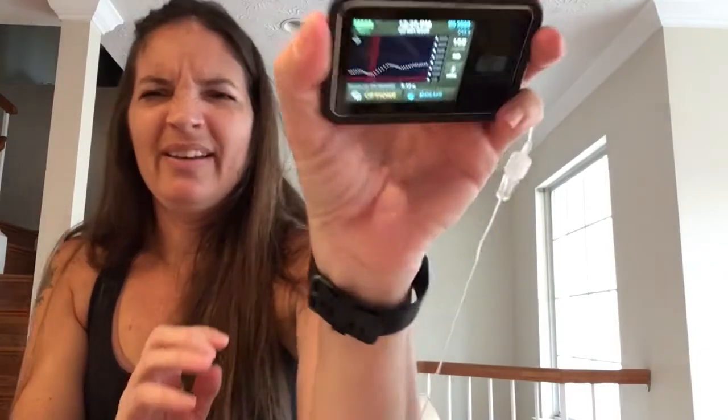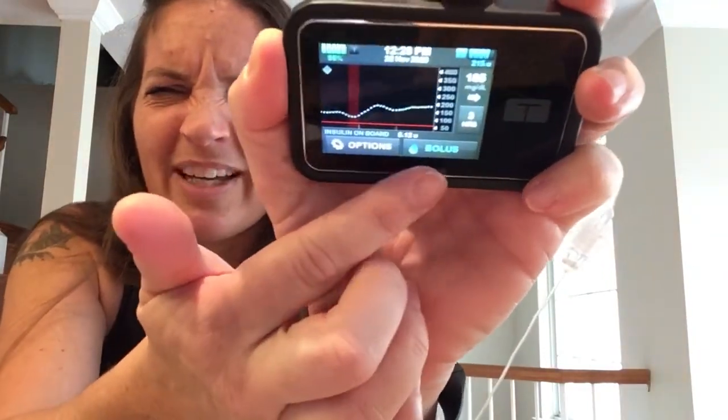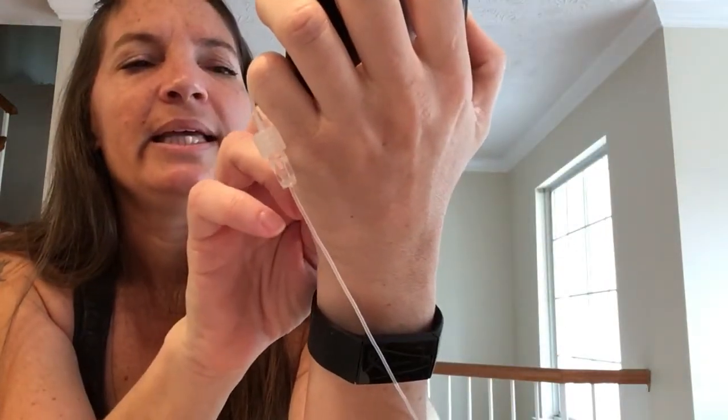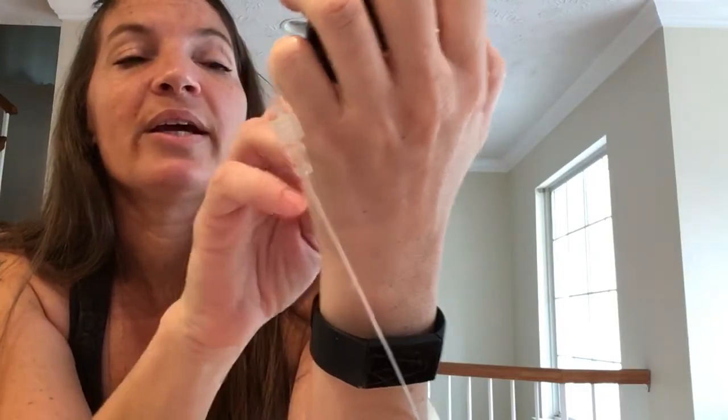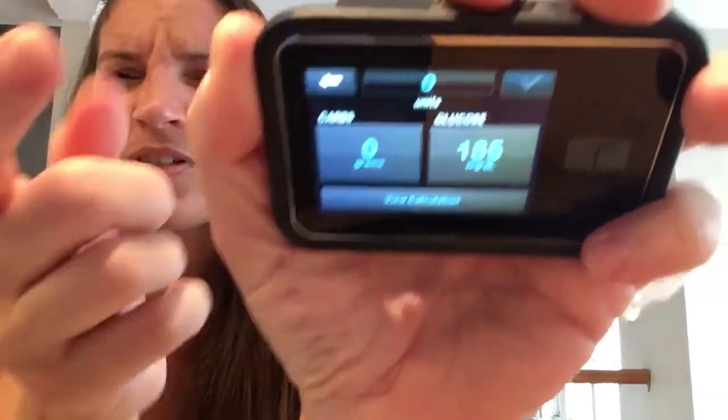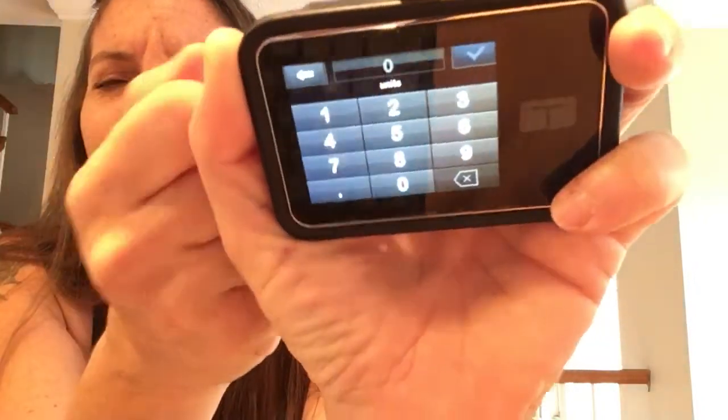Here is my bolus screen. What they're saying is if I go right up to the top and just hit Units, I can dial up any bolus I want — within the limit. If I just want to do a straight bolus without considering any other information, say I want three units, I would go into that top button and hit Units.